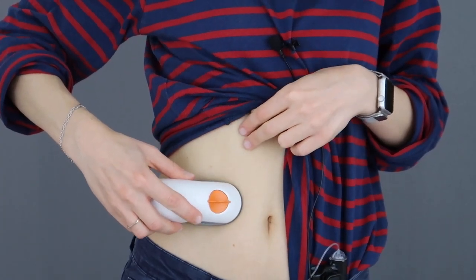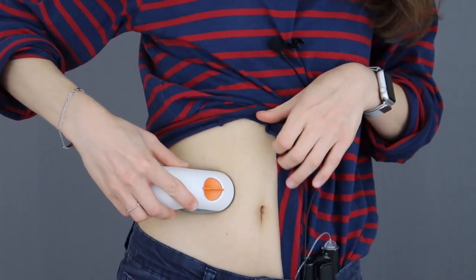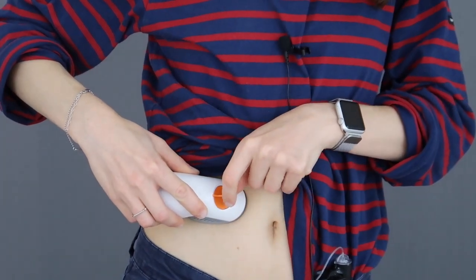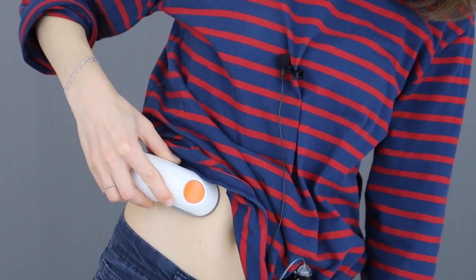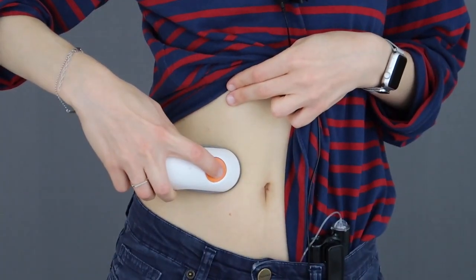Here we go — placement. Stick. Okay, I'm committed. No turning back now. Taking off the guard. So I've just removed the guard, the button is now exposed. One, two, three — hope it doesn't hurt.